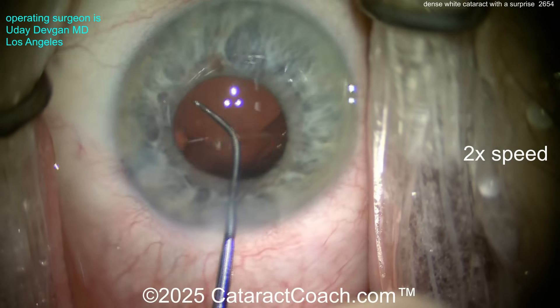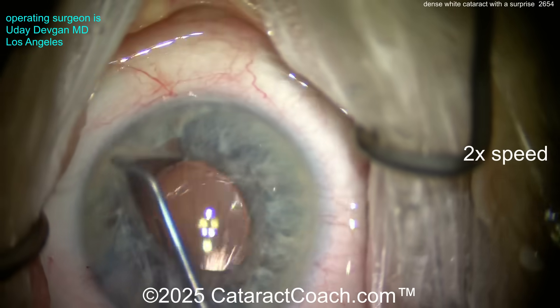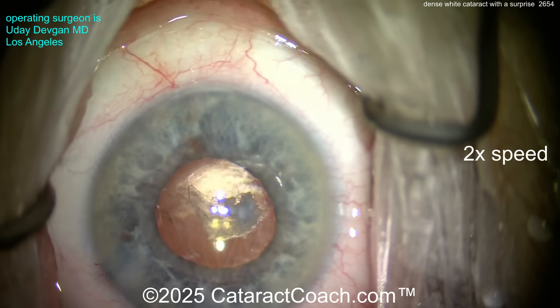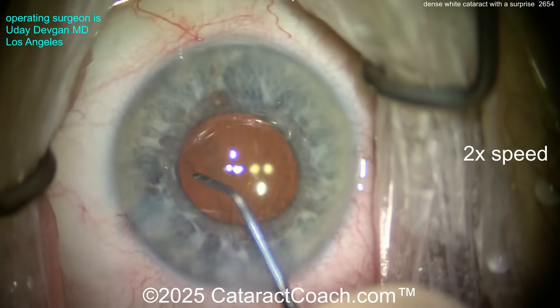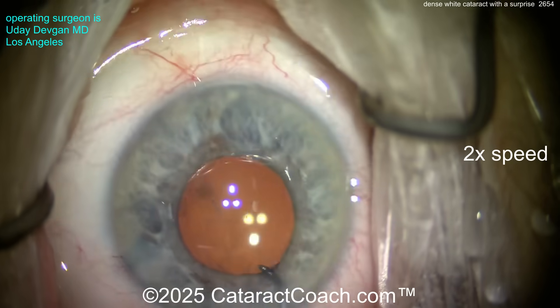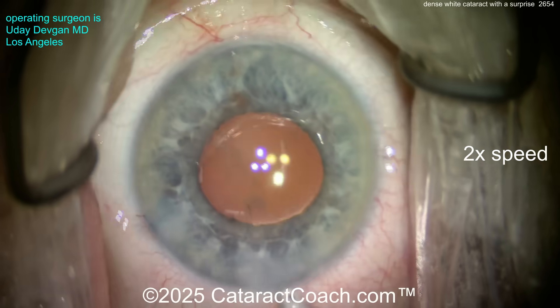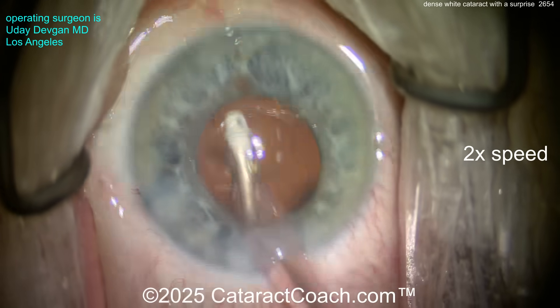Now you definitely need that chopper to ensure the lens is totally in the bag. Lift up the iris and check — make sure there's no residual lens material. Did you see that? Look at this surprise — we probably should get that out. There we go — that's why we check. A patient like this could have chronic inflammation after surgery wondering why, and it's retained lens material. Because the patient doesn't dilate in the post-op period you wouldn't even see it, so this is the time to check.